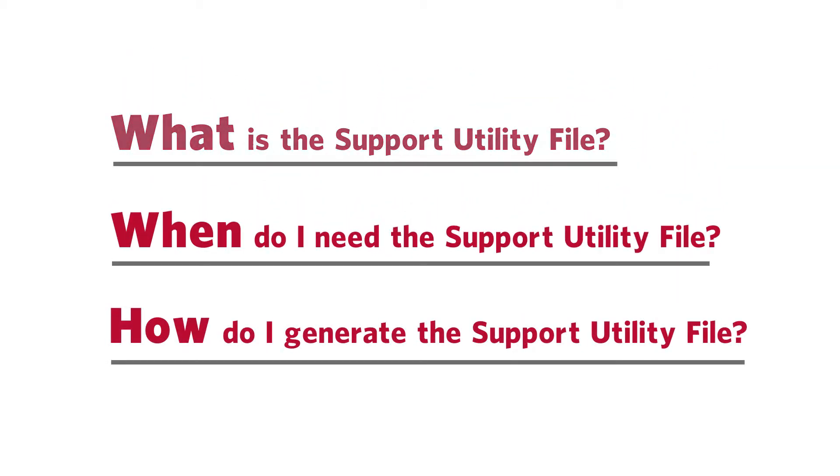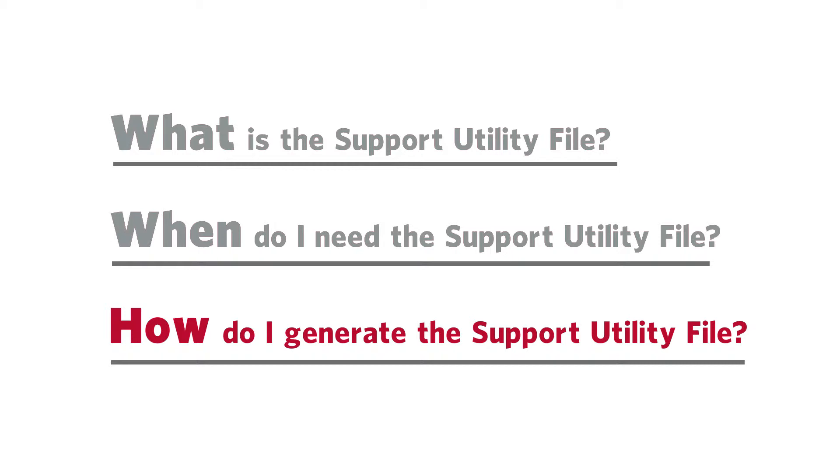Now that we know what the support utility file is and when we would need to generate the file, let's go over how to generate the support utility file.